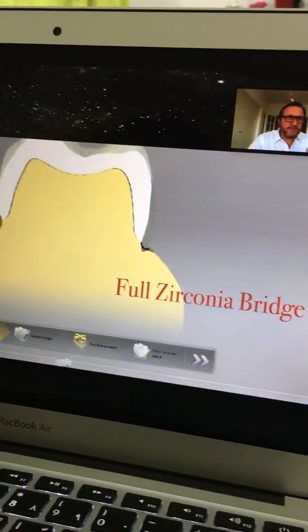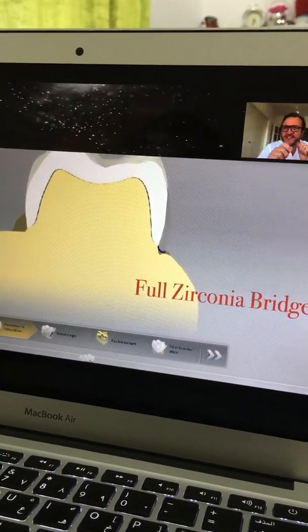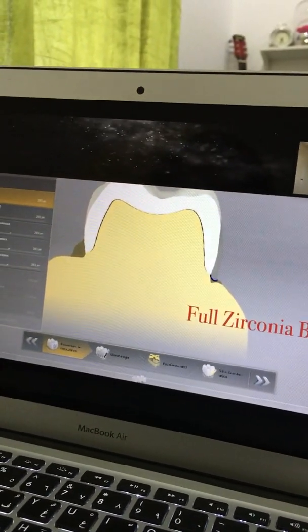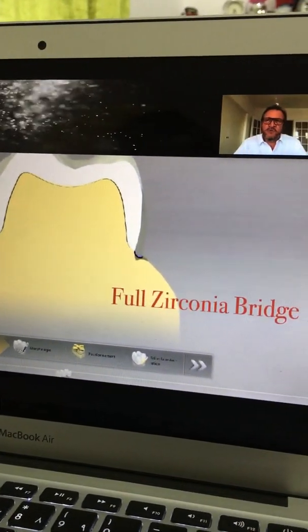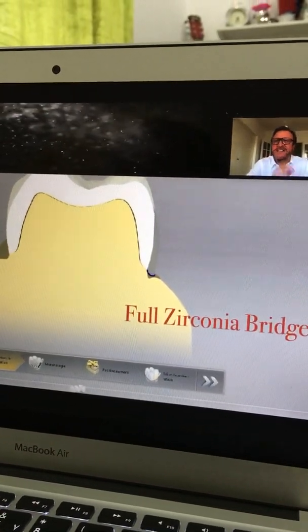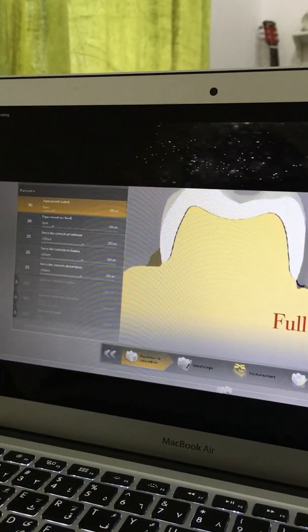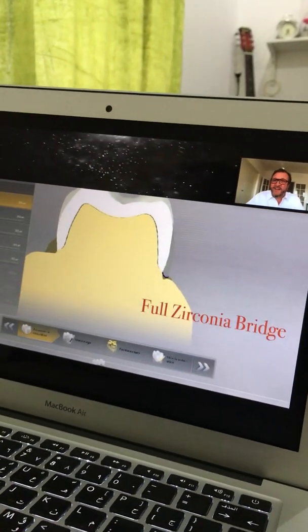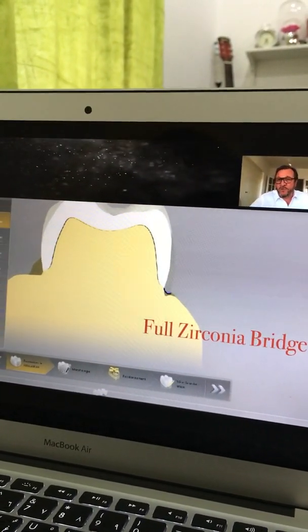Don't do something and say, okay, it doesn't matter, I can correct with my hand, it only takes 10 seconds. If you do that at first, 10 seconds, second time, 10 seconds, and 1,000 times, and you don't have the solution. So you have to have a different kind of mindset, which is to try to have the solution inside the software. If you have the solution inside the software, you have it for all the cases, and you don't spend time, and you earn money, and of course you can use that time to make better results, better aesthetics.